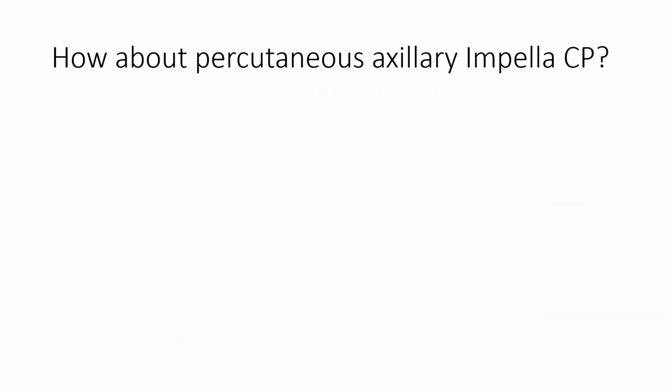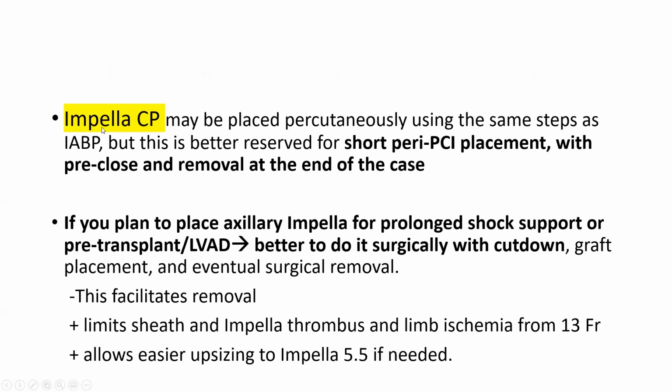The final idea here, how about percutaneous axillary Impella CP? Here is my take on it. Impella CP may be placed percutaneously using the same steps as balloon pump, the same understanding of the anatomy, the same combination of ultrasound and angiographic guidance. But percutaneous Impella CP axillary placement is better reserved for short peri-PCI placement, where you do pre-close and you remove the Impella CP at the end of the case. So percutaneous Impella CP is reserved for peri-PCI support, short use for a few hours, not long-term use.